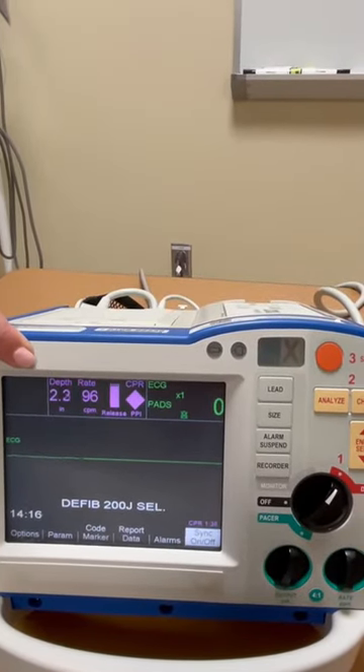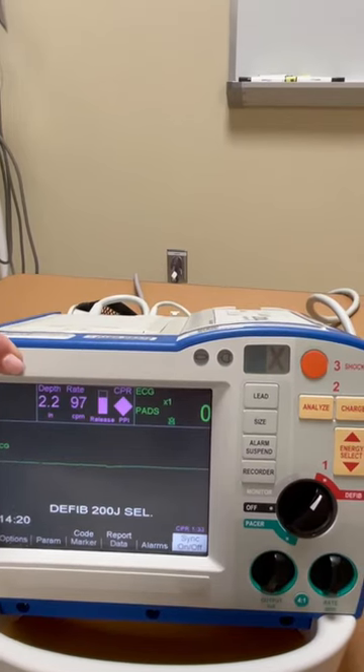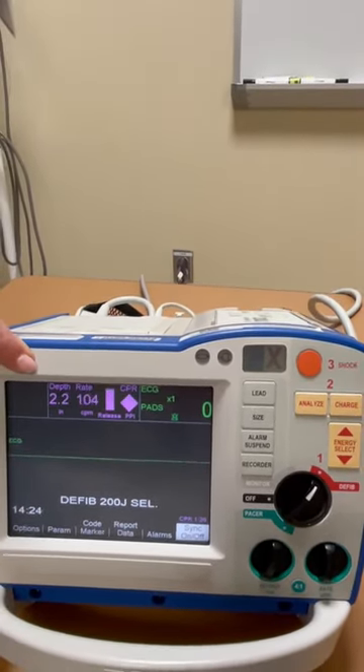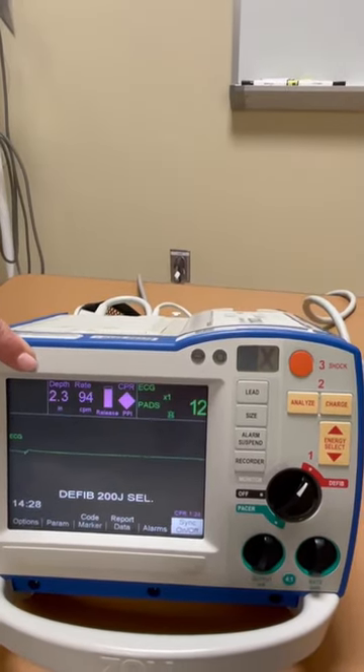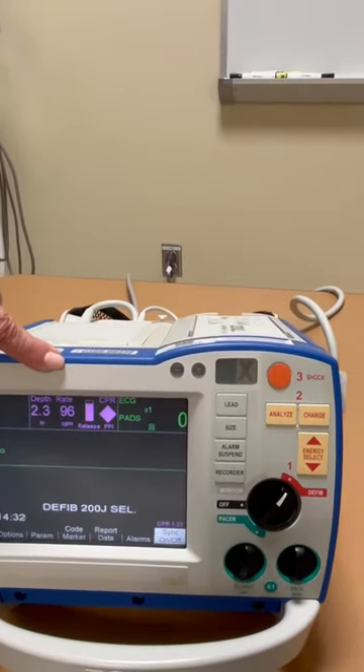Notice once Carly increases her depth, she gets a verbal reward from the monitor that tells her that her compressions are deep enough. The depth of your compression should be anywhere from 2 to 2.5 inches, and your rate should be 100 to 120.